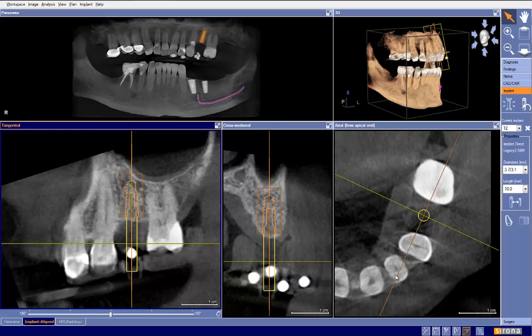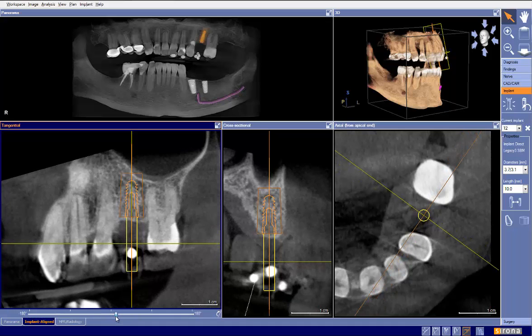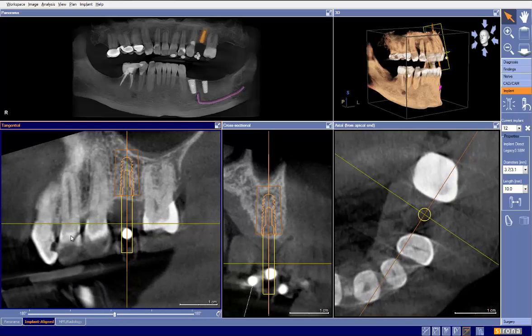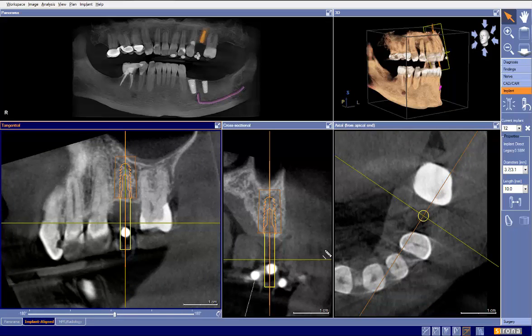Remember, this orange line right here represents where we need to see on the occlusal plane. So take your slider and move it just like so. So now we see a little bit more of those teeth. Now, what am I seeing here? What I'm seeing is that our occlusal plane is like so. And we do not want that. What we want our occlusal plane to be is that.